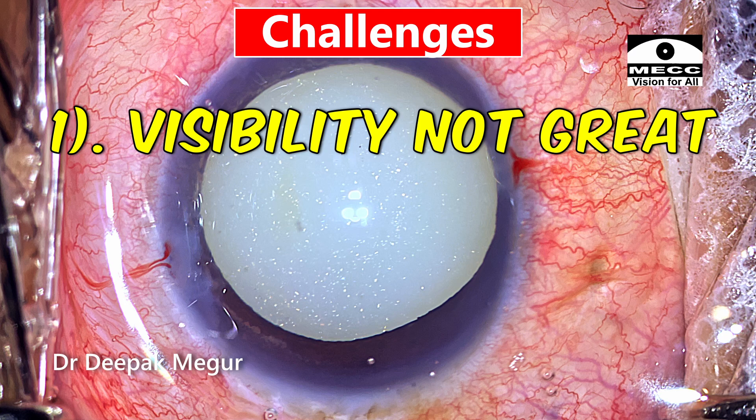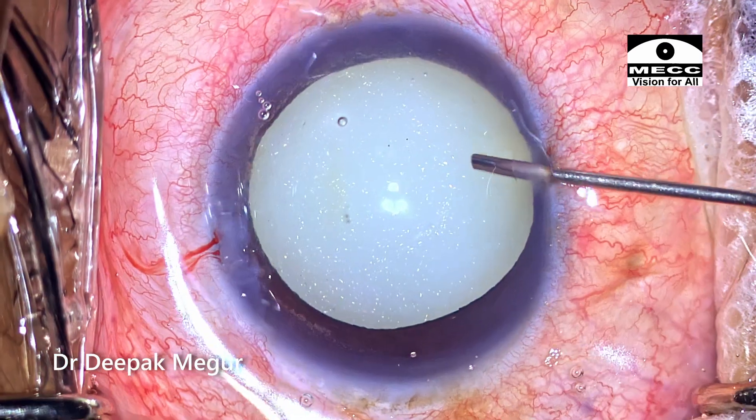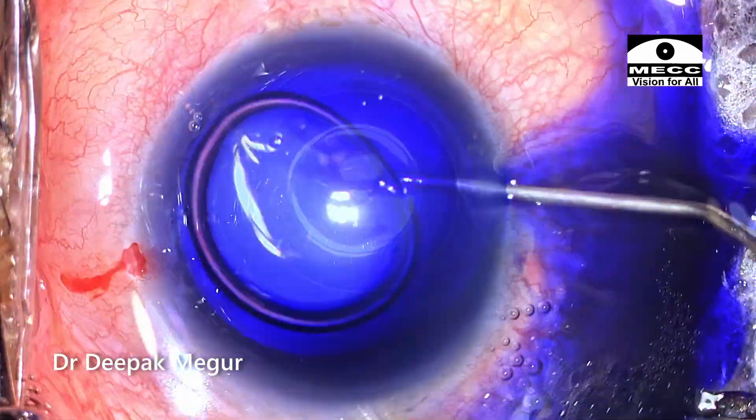The visibility is going to be an issue because the corneal edema is still there. The fluid cortex is going to come out as soon as I puncture the anterior capsule, hampering the visibility. The zonular health will only be known when I puncture the anterior capsule and perform the rhexis. So zonular health is another concern for me.